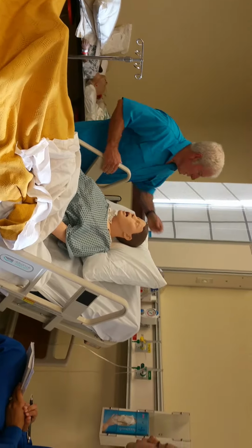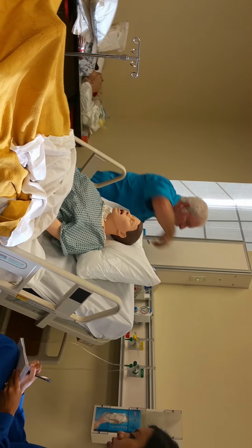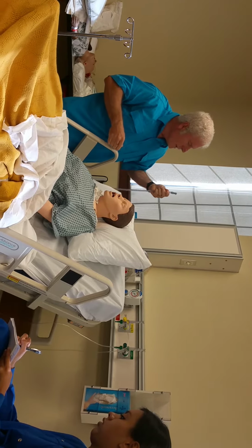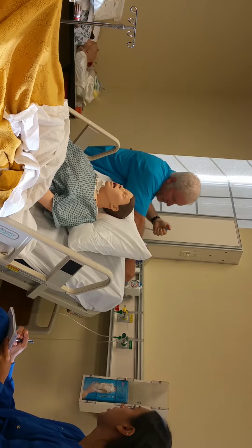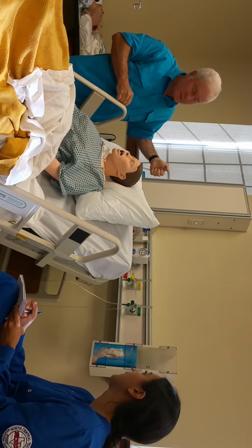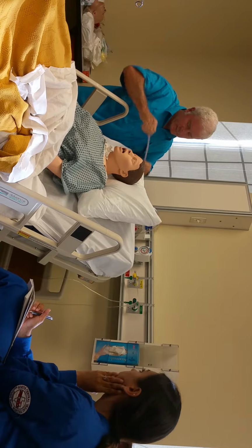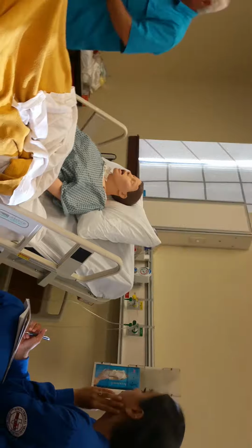So I got him sitting up where I want him. I'm going to get my suction going, and I want you guys to do this too. I actually want you to turn the suction on. You're not going to really get a reading here unless you put your thumb over the end of it, okay? And just put it down in the green range, because the order is going to be for low intermittent suctioning. So that would be in the green. So I've got it set right where I want it, and I'm just going to leave it running. And I'm just going to set the tube right there where I can get to it. Get my other stuff over here.